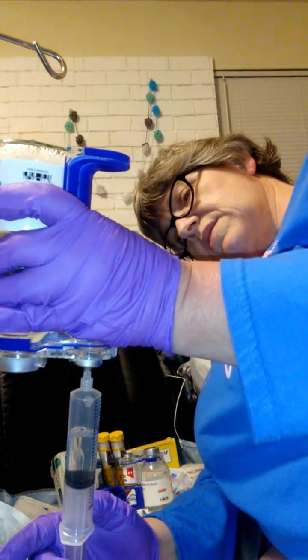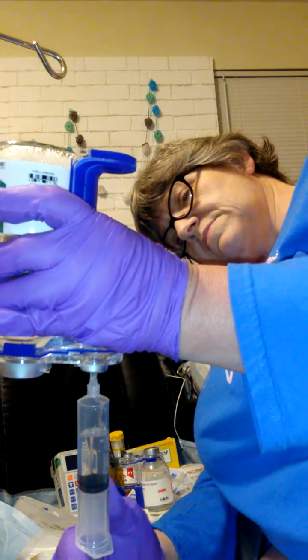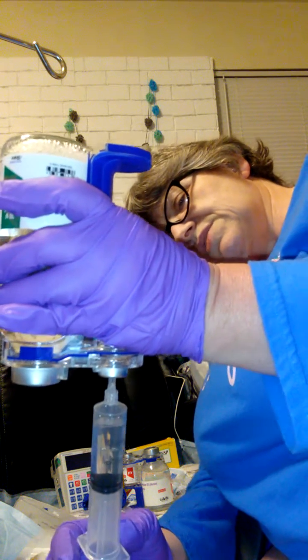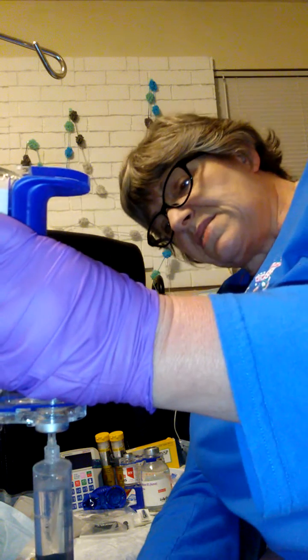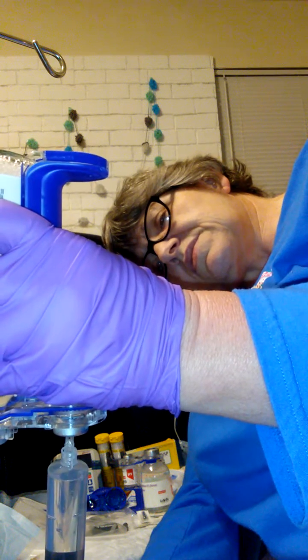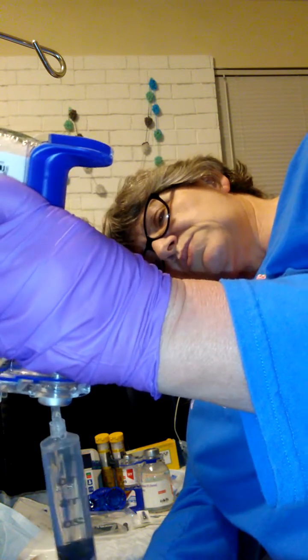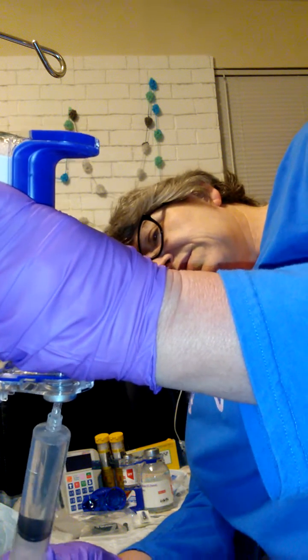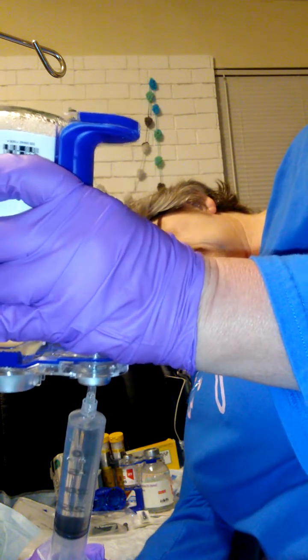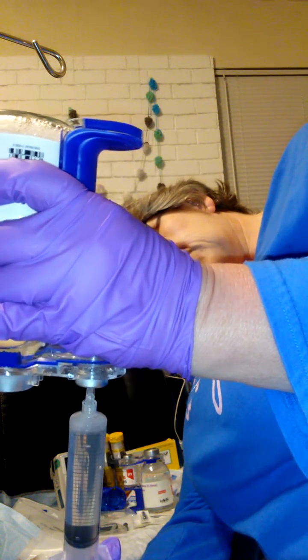Put a little air in. And it's going to push itself out, pretty much. Get a little more going on here. Get all these bubbles out. Here goes. As you can see, that medicine is coming out. And a little more air. Bubbles are coming out of there. It's coming down. As I do that, I always wiggle this a little bit to get my blunt needle down so that I can get as much of that HY out of there as possible. I don't want to leave anything in there.